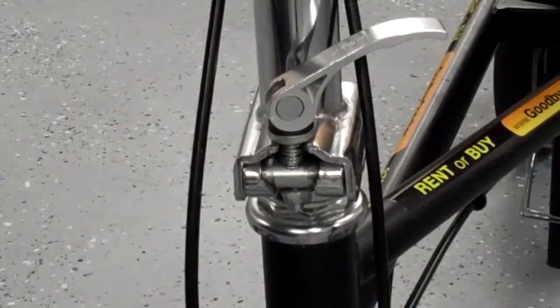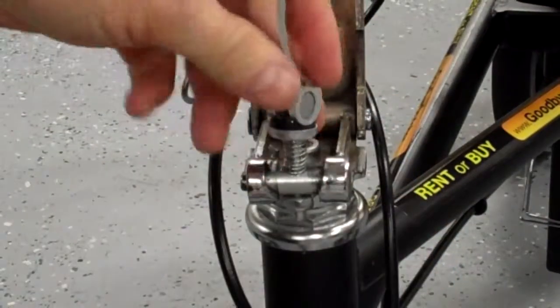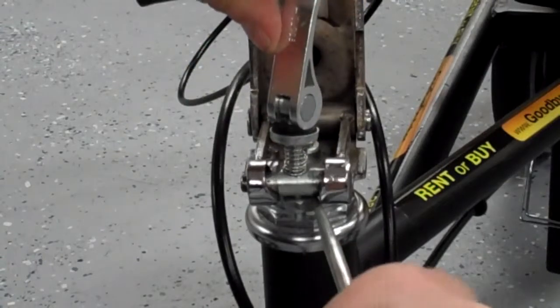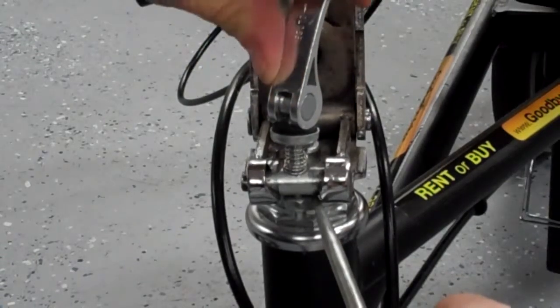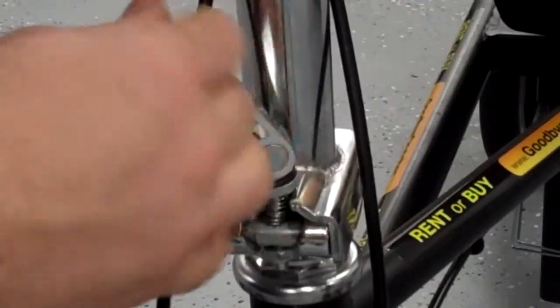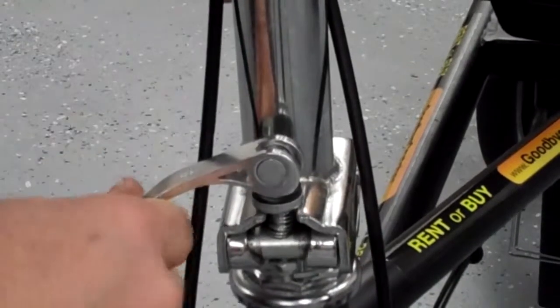If you'd like to make it looser, do just the opposite. Put the screwdriver in there or a knife to hold the nut, and then turn it counterclockwise or to the left. So you can see that's much looser now.